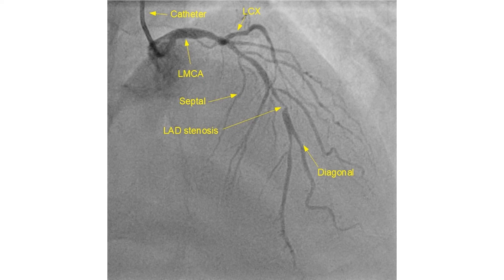The transradial catheter used in this case was a Tiger catheter. The same Tiger catheter can be used for both right and left coronary angiography, thus avoiding a catheter exchange and the potential risk of radial artery spasm.